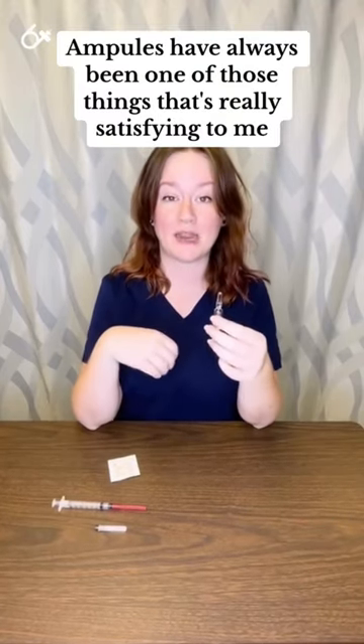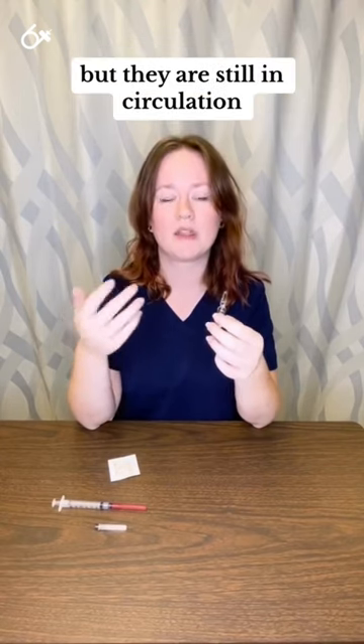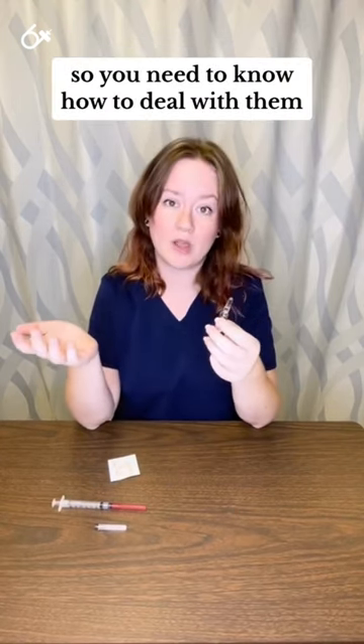Ampules have always been one of those things that's really satisfying to me. I don't think they're as frequently used, but they are still in circulation, so you might see them, so you need to know how to deal with them.